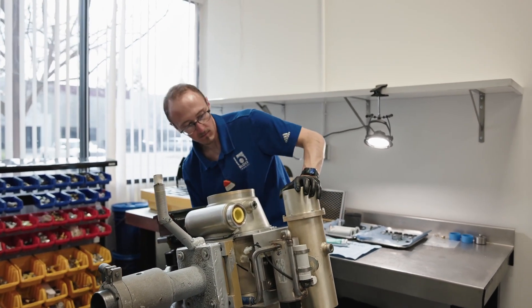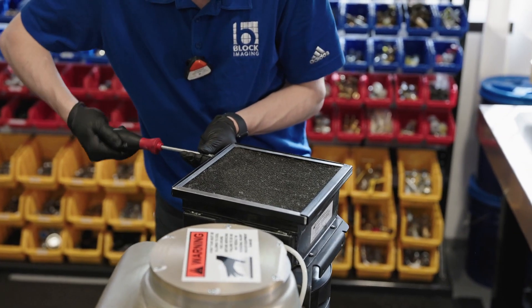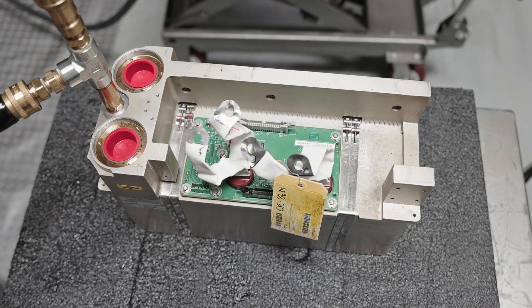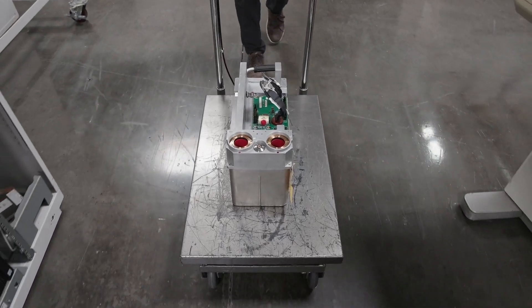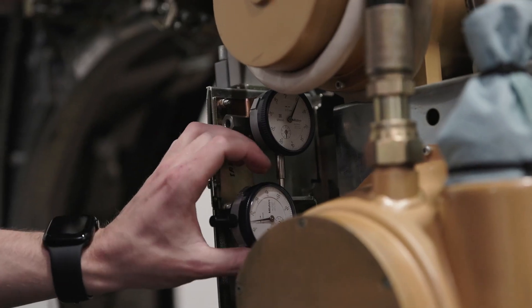As we look at the quality performance of X-ray tubes, one of the important things is to measure warranty or failure rates to ensure that the processes in place are meeting customer demand. One of the things we put in place to avoid failures is to go through rigorous system testing before a tube would leave our door.